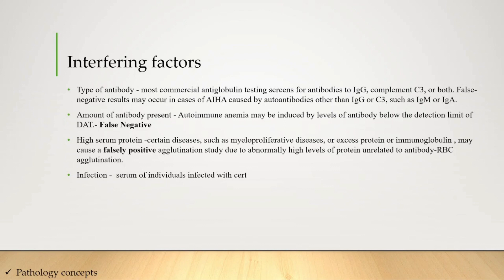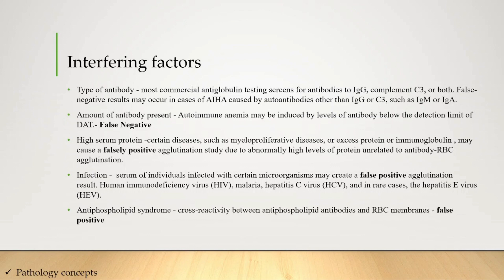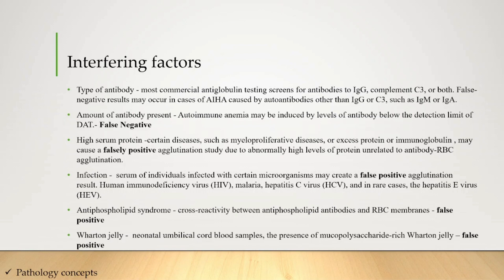Fourth, infection: serum of individuals infected with certain microorganisms may create a false positive agglutination result — HIV, malaria, hepatitis C, and in rare cases hepatitis E virus. Fifth, antiphospholipid syndrome: cross-reactivity between antiphospholipid antibodies and RBC membranes can give a false positive result. Sixth, Wharton's jelly: in neonatal umbilical cord samples, the presence of mucopolysaccharide-rich Wharton's jelly in the DCT can give a false positive result.